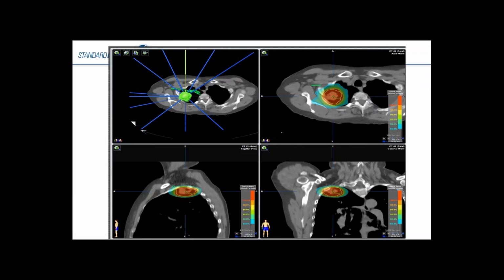So before we talk about specifics on the Lucy Phantom, I really just want to show a screenshot here from a treatment plan to get everyone on the same page of the fact that we are looking at some very high dose delivery techniques that need to be highly precise. This is a very high precision therapy mode, and that's always something to keep in mind when we're going through our SRS QA procedures or measurements or tasks.